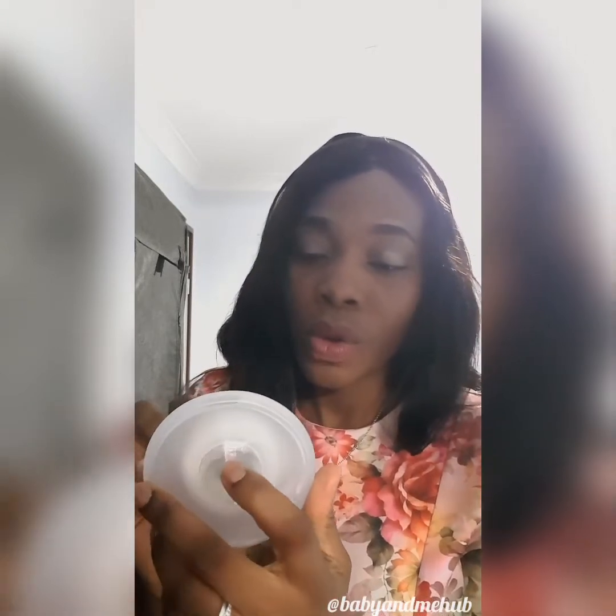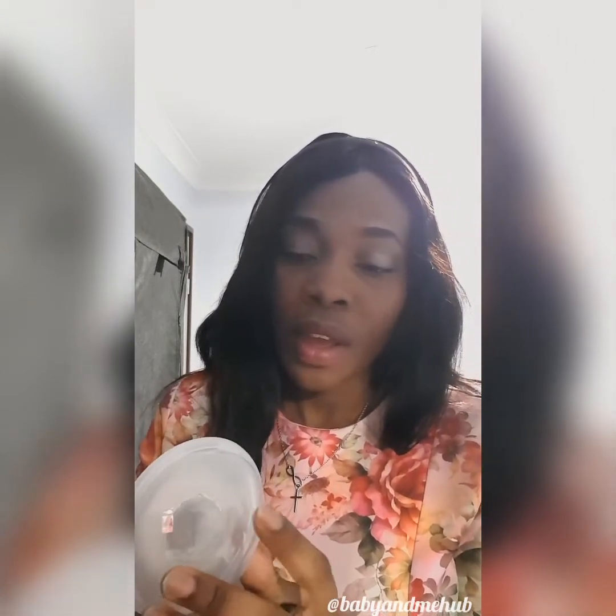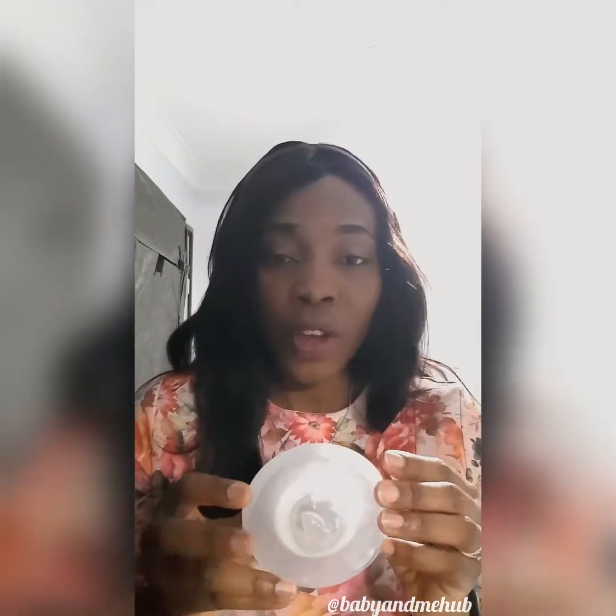It's very easy to wear — this hole here is where your nipple goes in, and then you insert it properly into your nursing bra. It's very comfortable; you wouldn't even feel that you are wearing it, and most nursing bras are padded anyway.